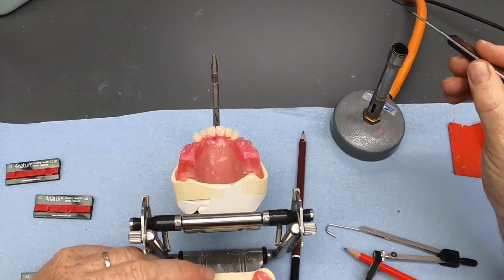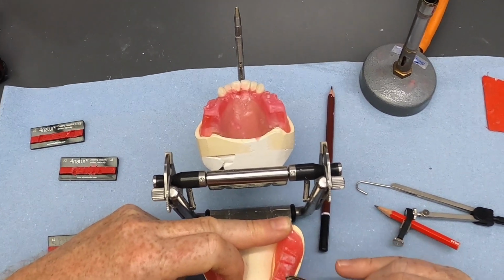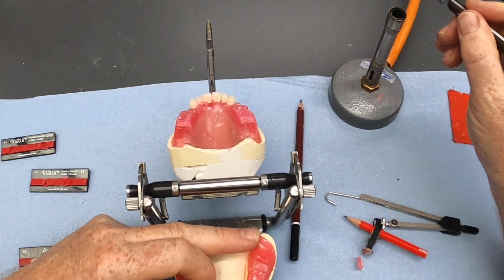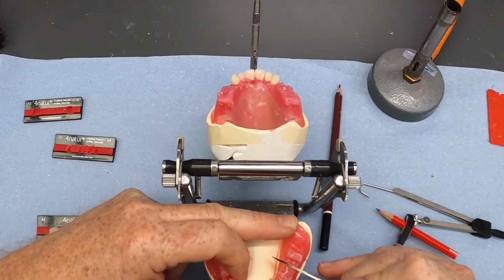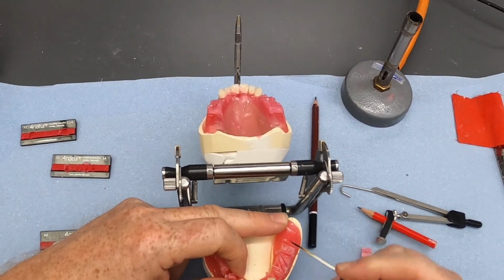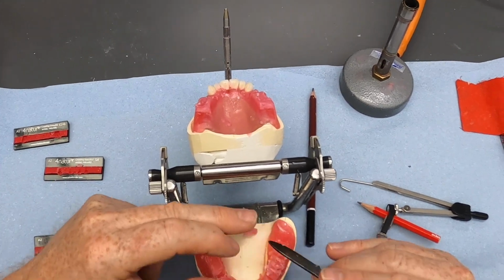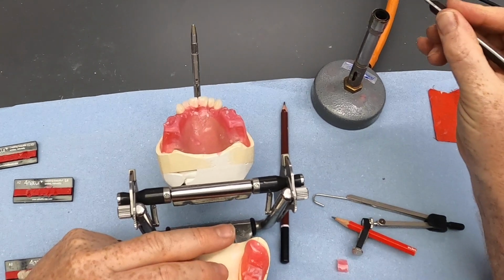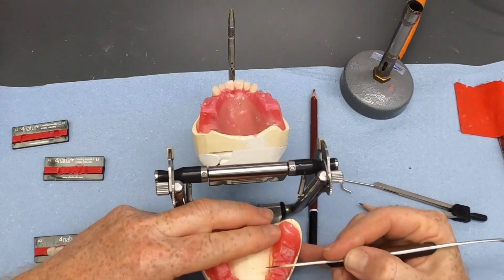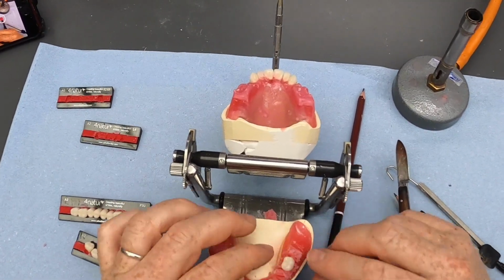So we can take our knife, cut away at the block. We've got a little bit of reference here for the occlusal plane. Soften the wax underneath, and then we can start positioning the lower six. The lower six wants to be positioned so that the cusps are pretty much even in the occlusal plane, going across the arch, up very slightly at the back if necessary. We might do some fine adjustments to that once we get the other teeth in, so particularly the upper six.